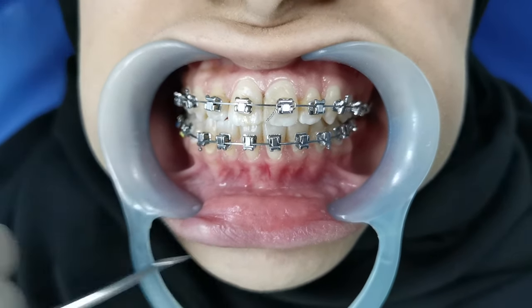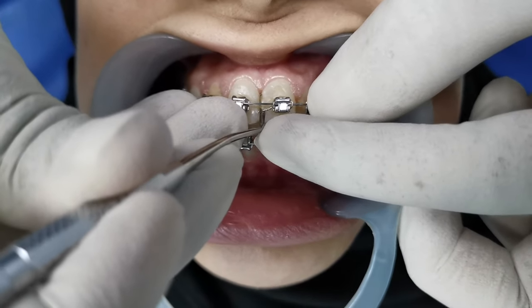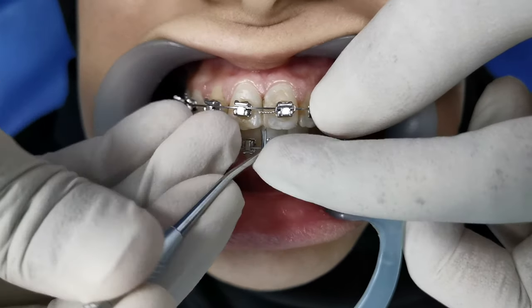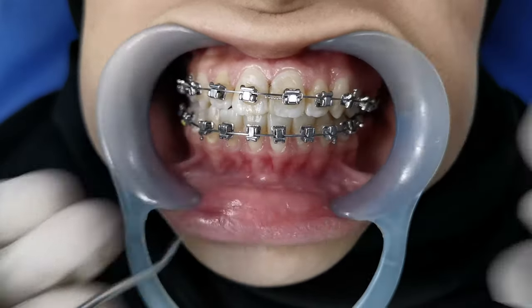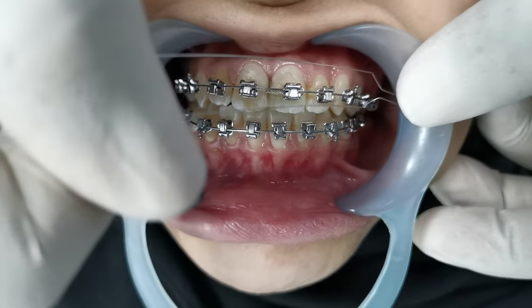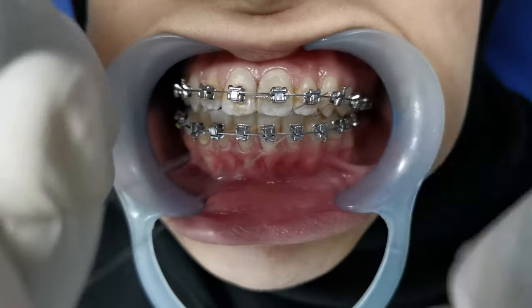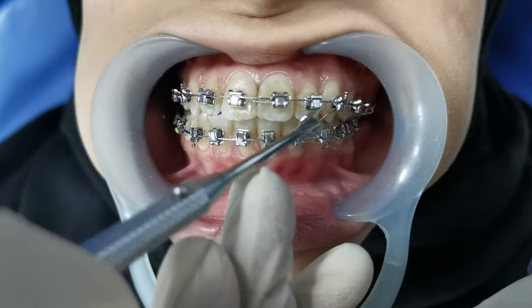The extra part you need to bend in by using the ligature wire director in this fashion. You can bend the cutting part inside — by that the patient will not have any discomfort. This is how we do the single ligature wire on a bracket. Now I will show you how to do the continuous ligation.